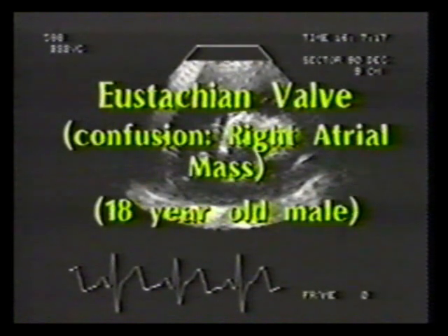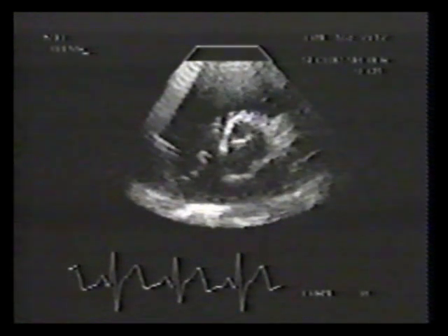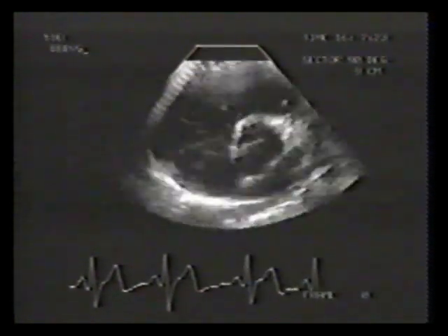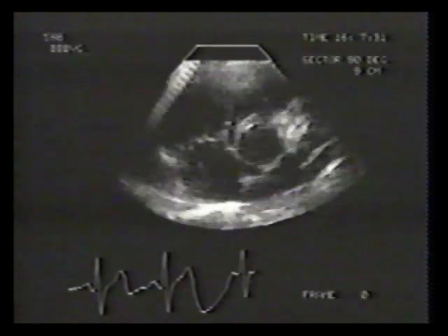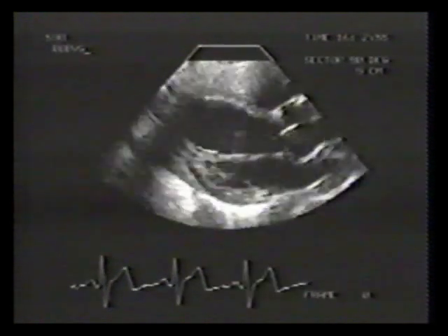The last masquerader is a large redundant eustachian valve, typically seen in younger patients, confused with atrial myxoma, thrombus, or tumor. Its attachment is at the orifice of the inferior vena cava. Note, in real time, the eustachian valve has an undulating motion within the right atrial cavity. It has a picture similar to that of a migratory thrombus. Its location at the orifice of the inferior vena cava is diagnostic.